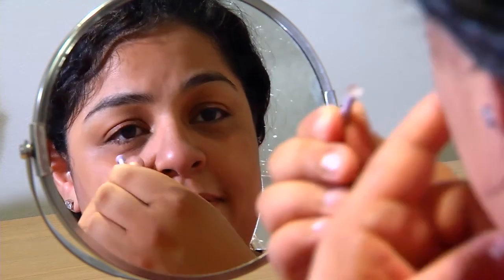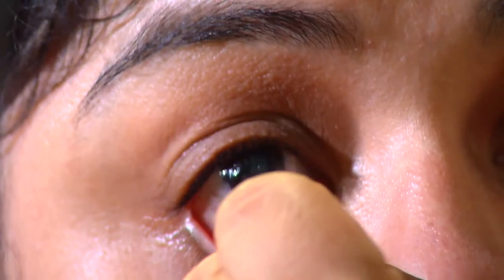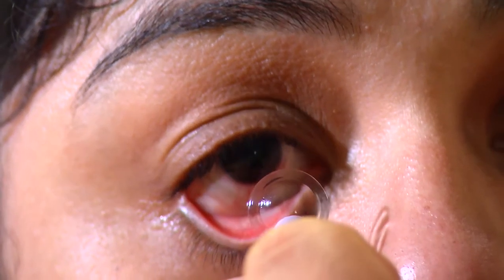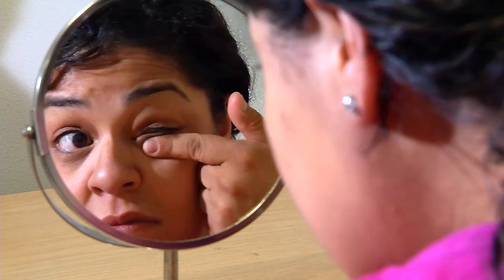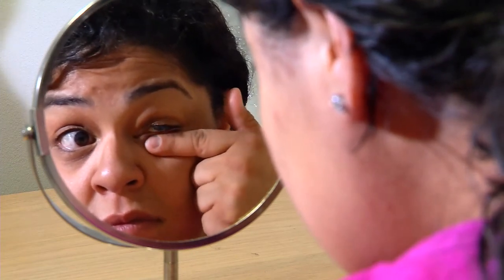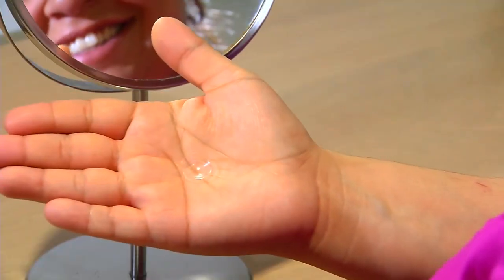Looking straight ahead, position the DMV remover on the lower portion of the lens, just below the pupil. Once you've made contact with the scleral lens, gently lift the lens away from the eye with the suction cup. You may also use a finger from your other hand to gently push the lower lid against the lower edge of the scleral lens to break the suction, making it easier to remove the lens.